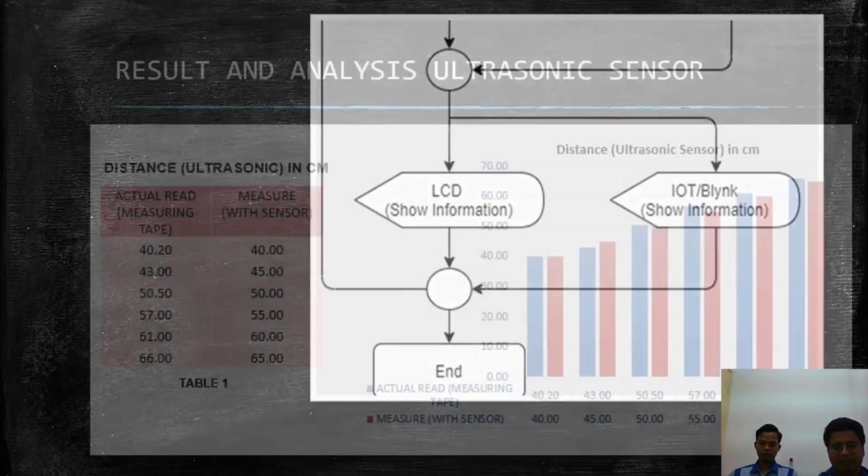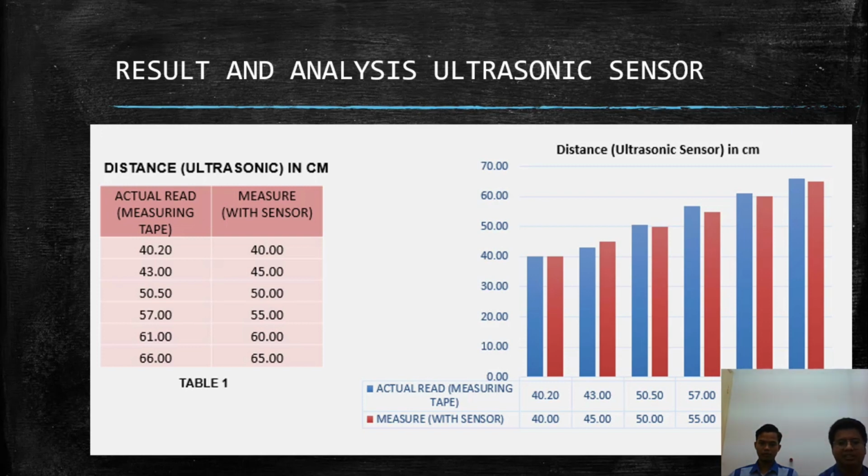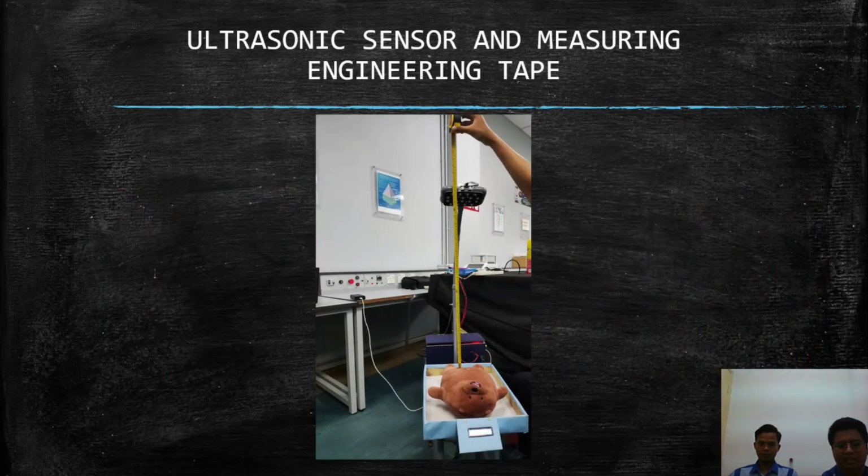This is the result analysis for the ultrasonic sensor. We use a measuring tape to compare with the ultrasonic sensor. We have a slight difference, not too much, below 10%, because for the reading, 43 on the measuring tape, the sensor provides 45 cm. So this is the actual chart comparison. This is our picture of the measuring tape measuring from the baby to the lamp.